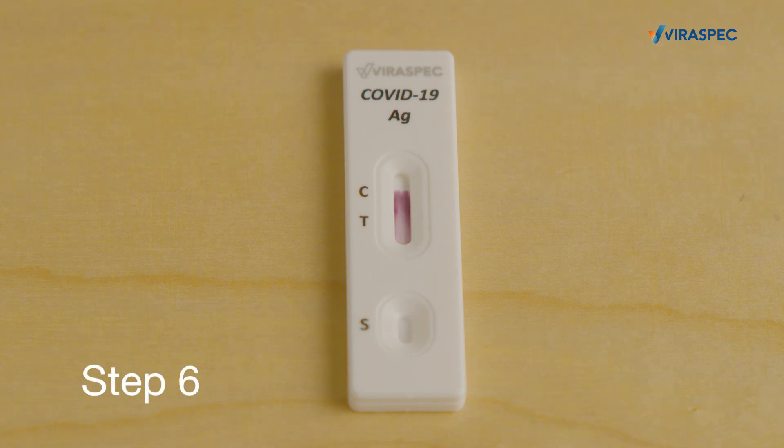Step 6 — The result: If there is one line by the C marking, your test is negative. This means that you don't have COVID-19.